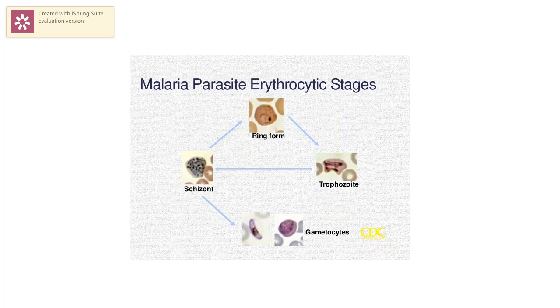Here in this slide, you can see the actual or real images of the malarial parasite when we observe it under the microscope. On the top, you can see the ring form, which students can recognize easily by observing the ring-like structure inside the RBC. Then you have the trophozoite stage, where you can see the haphazard movement of this parasite inside the RBCs. And then starts the schizont stage, where you can recognize small dot-like structures and the growth of this malarial parasite inside the RBCs.